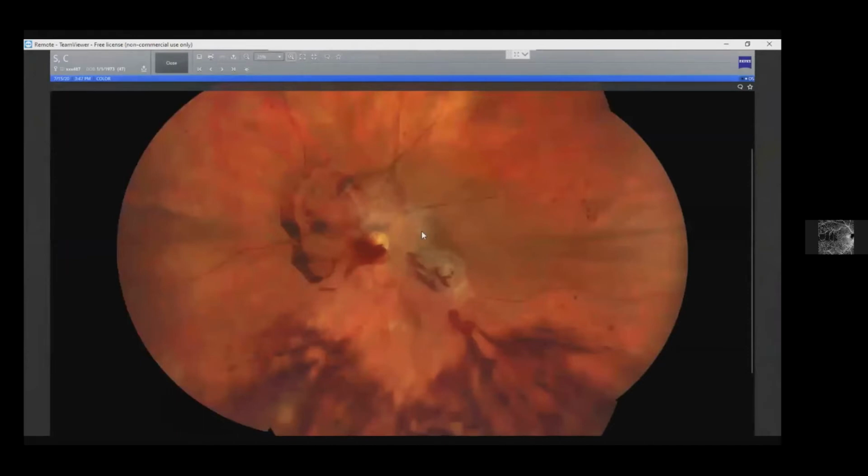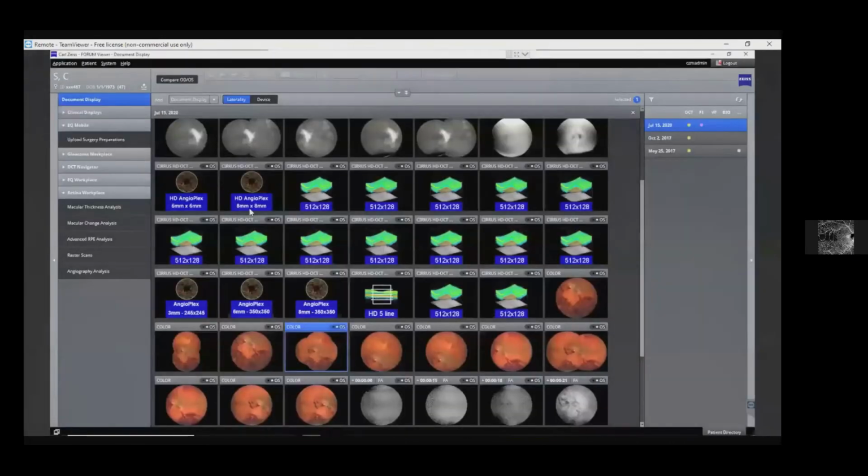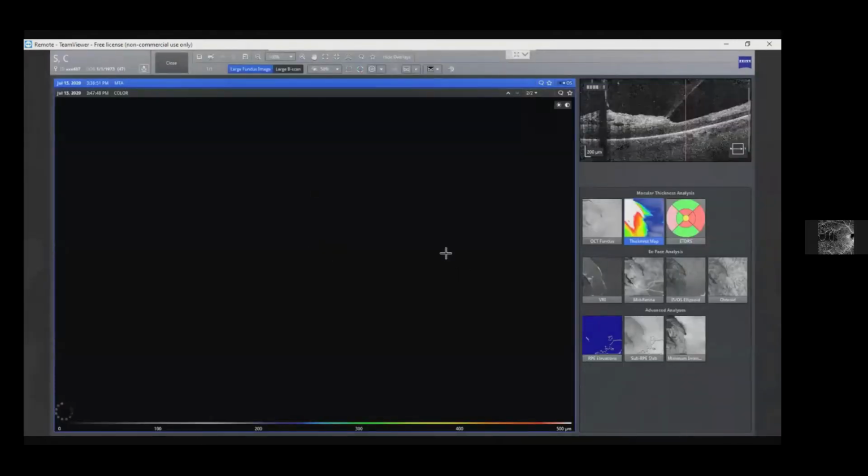This patient, unfortunately, probably needs surgery, right? The extent of fibrosis here makes me concerned for anti-VEGF therapy or a pan-retinal laser. I'm concerned about inducing some contraction, actually inducing a macular tractional detachment. But patients who need surgery sometimes like to get a lot of different cubes to look at different areas of the fibrovascular complex, again, to kind of establish surgical planes. And that's what I did in this patient, so I can show you how the overlays work in that situation.